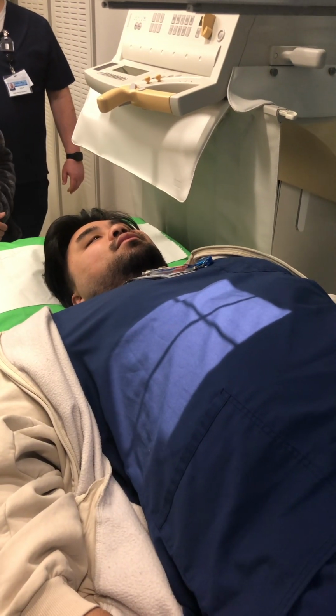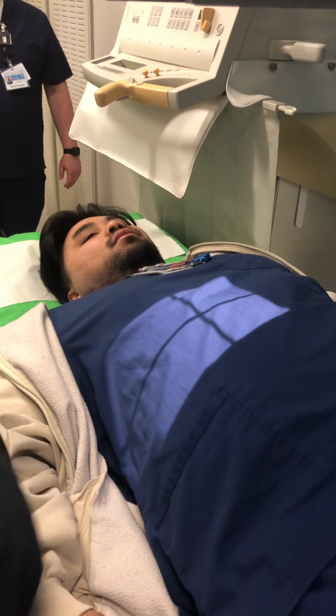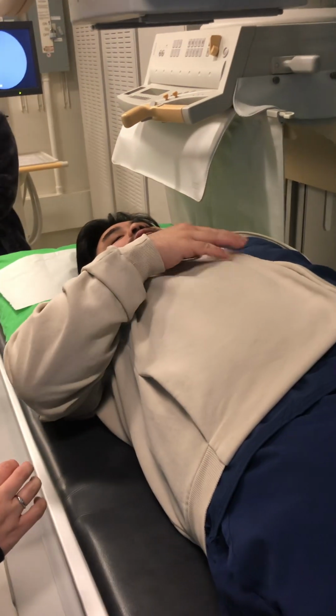All right. Then we need to do an oblique. Did they leave their sponge wedge? Oh, no, they were good and they put their sponge wedge away. Let me go grab it. Wedge, please. All right. Bring that one up.